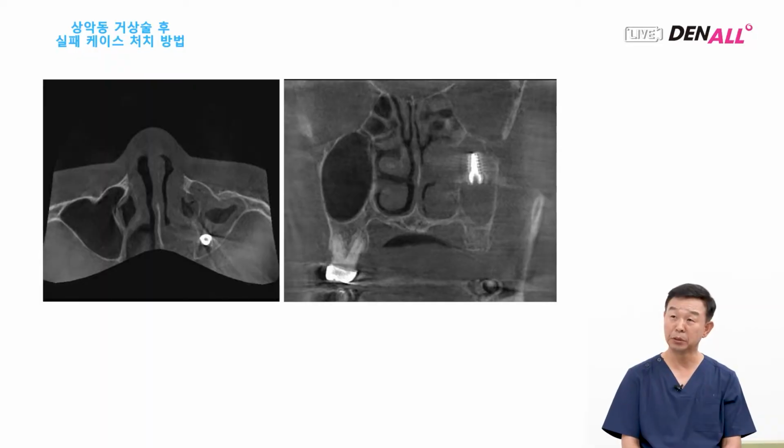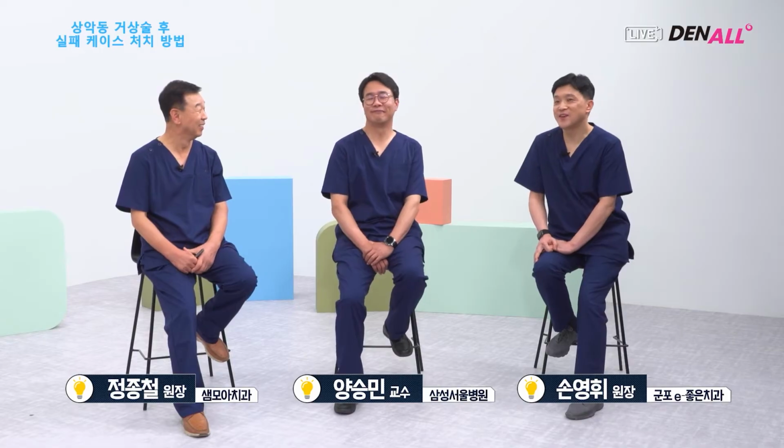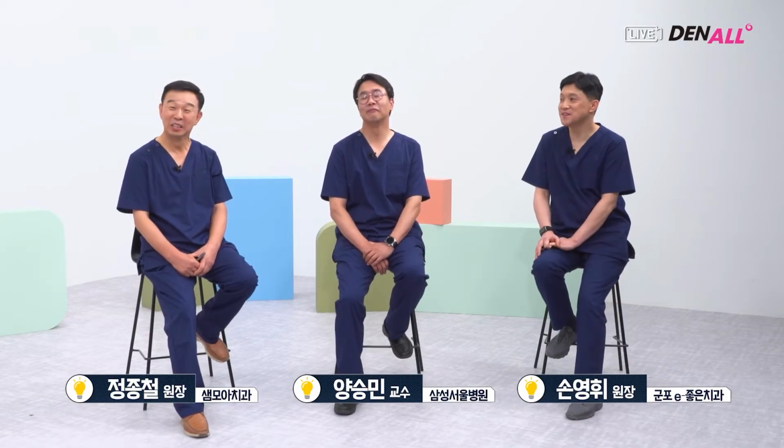On the CT, it is not exact, but the granulation tissue is surrounding the fixture, right? Yes, it is buried in the soft tissue. It will be challenging to remove it. Dr. Son, have you removed such implants a lot? Not many, but I have experienced it several times.